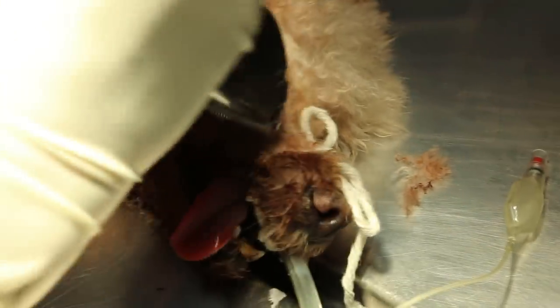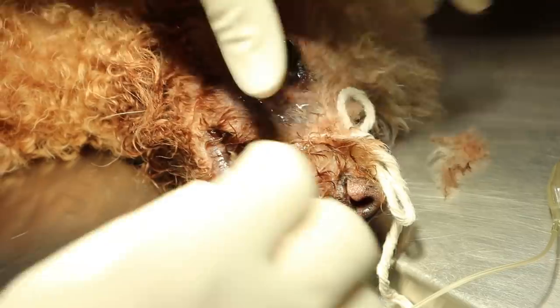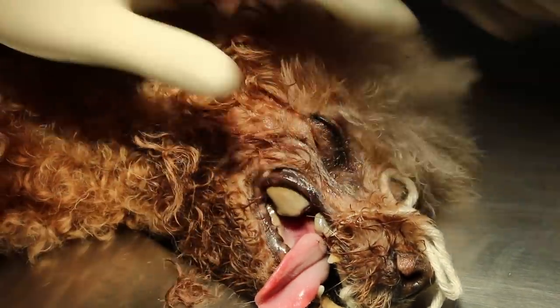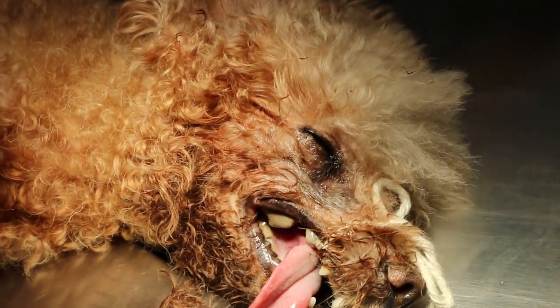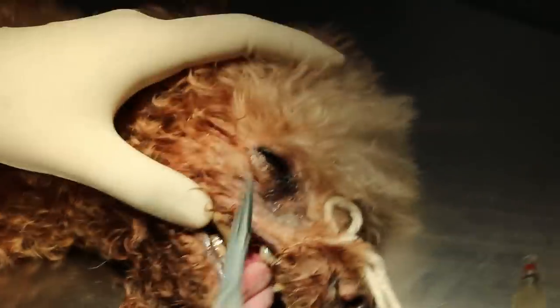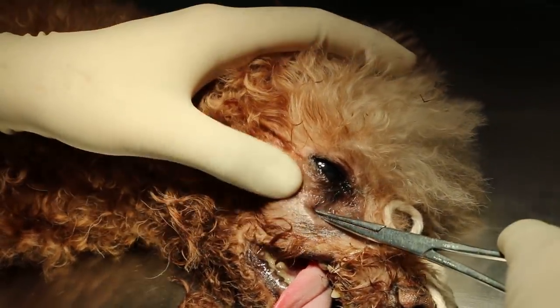So we show the premolar 4 root. Open up. You can see that there's a hole going into the root of the wound up there. You can see this is the oral-nasal fistula — it's an open wound.